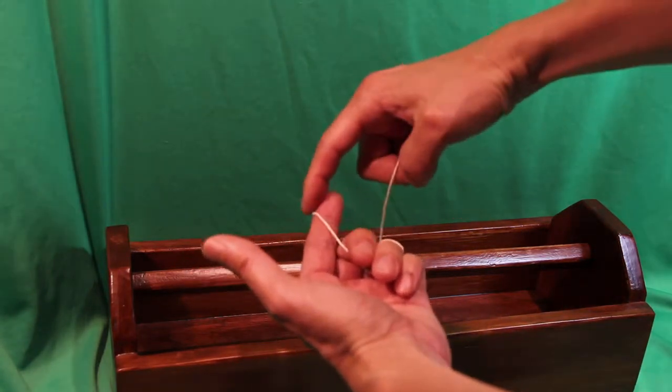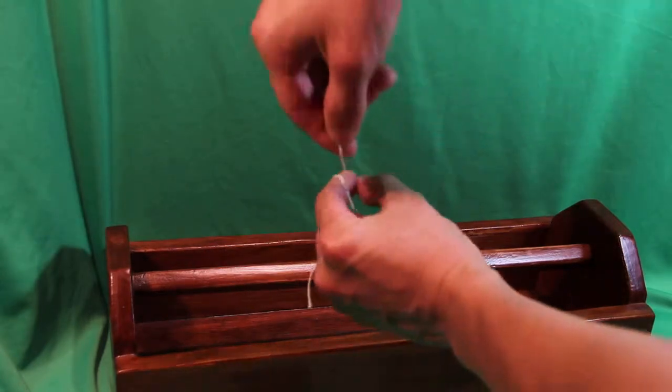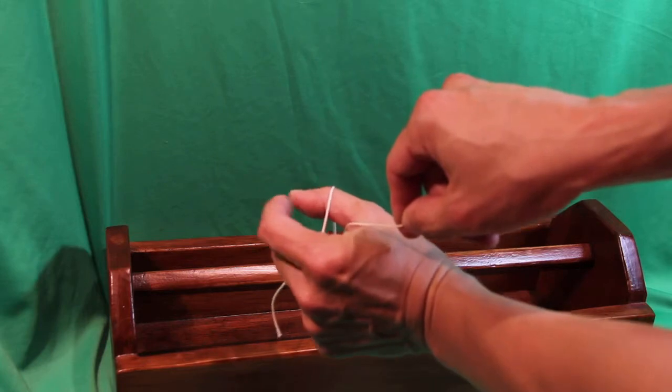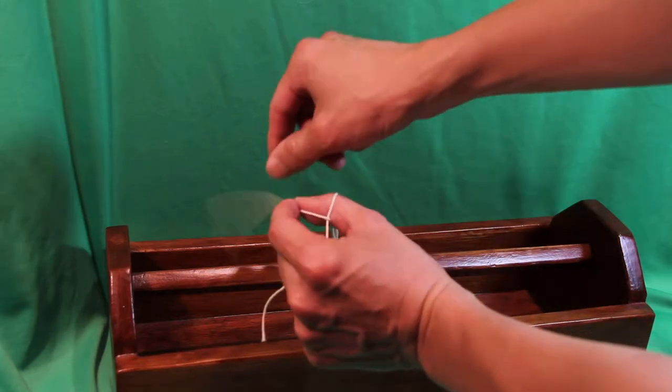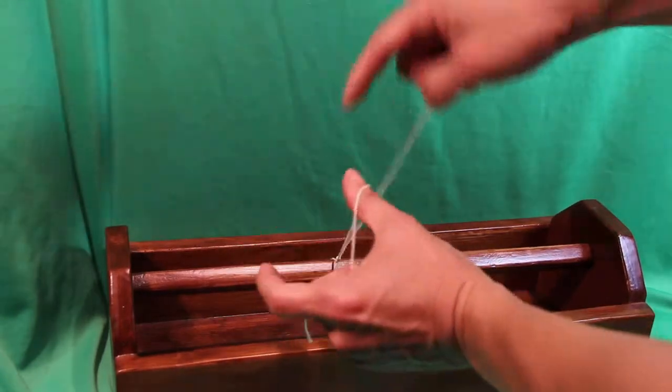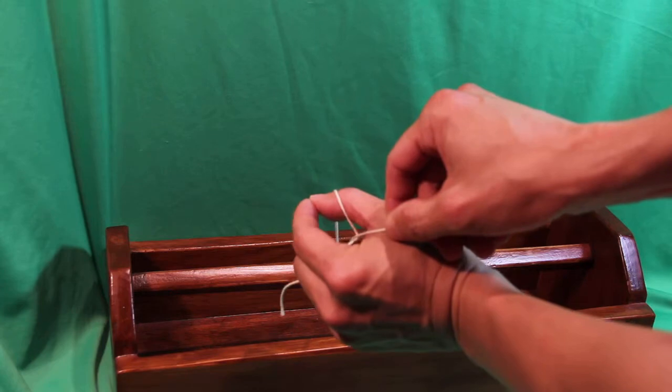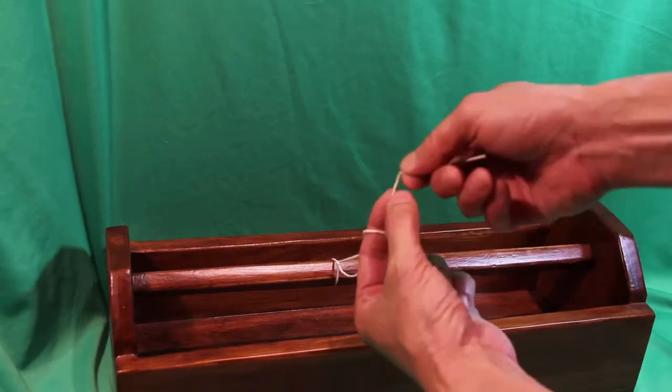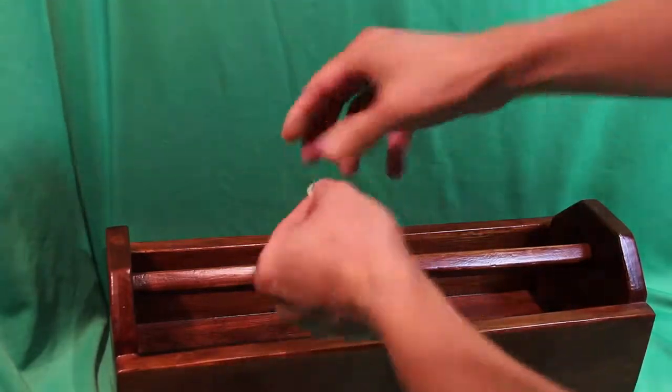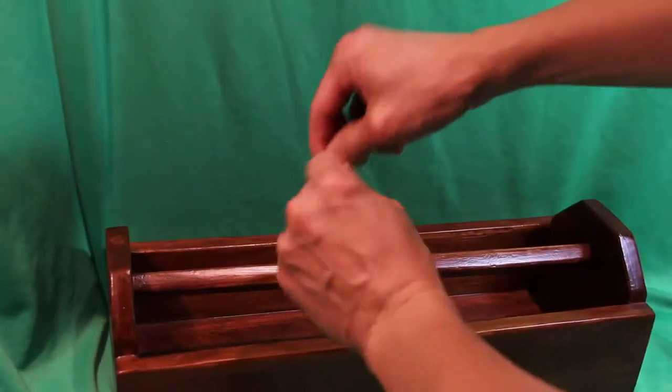Stabilize suture over index finger. Go under to create a cross. Bring these two through the index thumb, through the loop. Grab the strand, pass it through. Next step, use your thumb. Take this strand across, pinch, come under, pass the strand, back across. And you do this over and over to create your square knot.